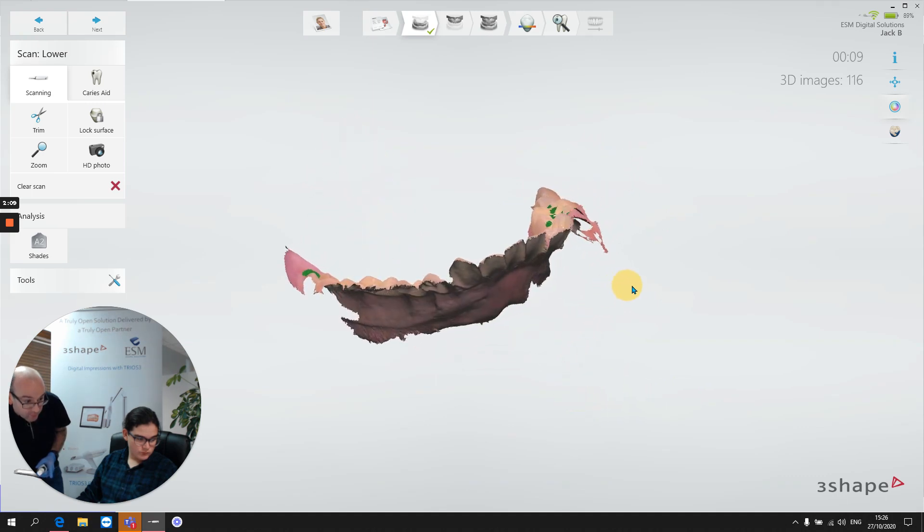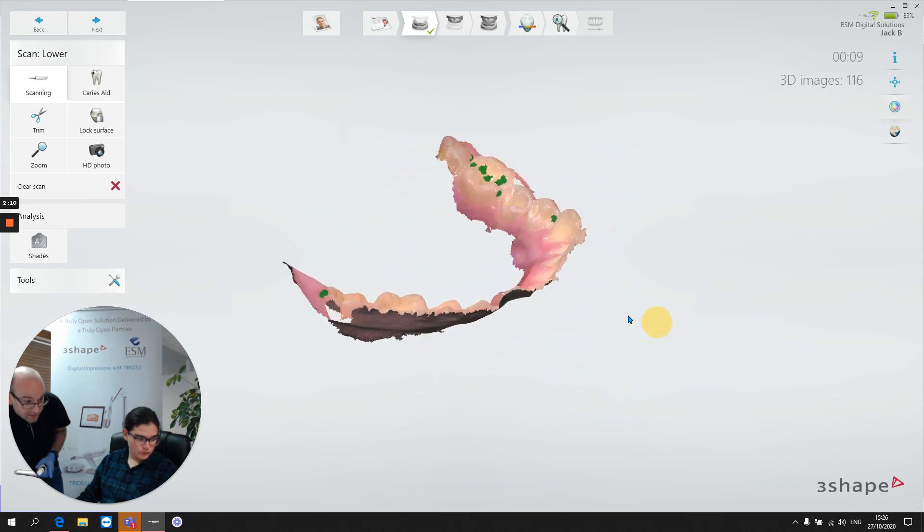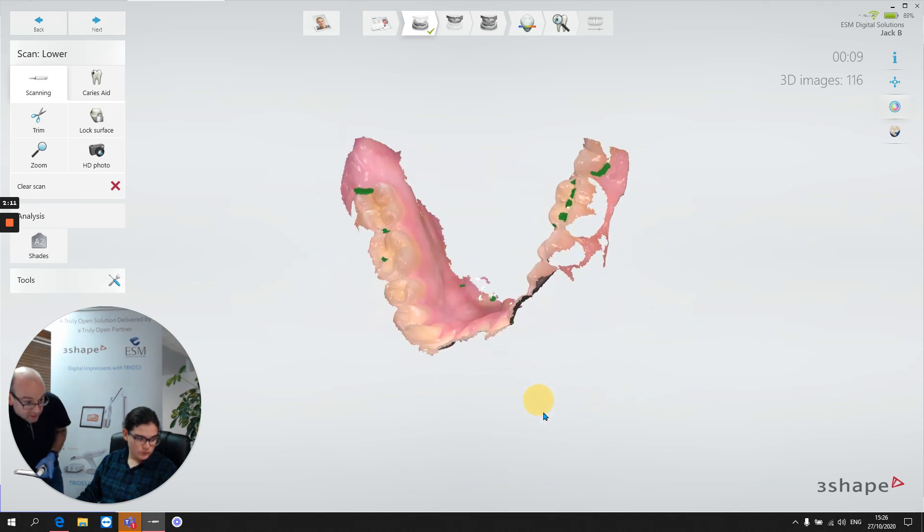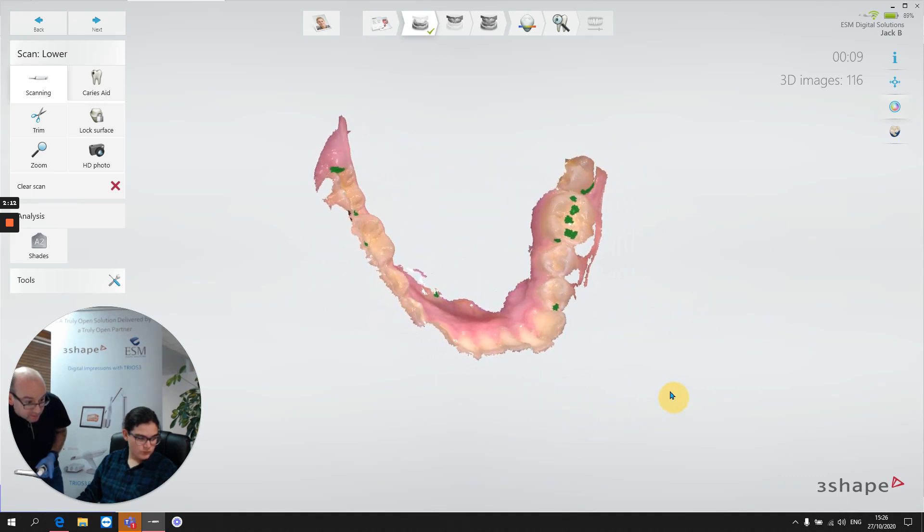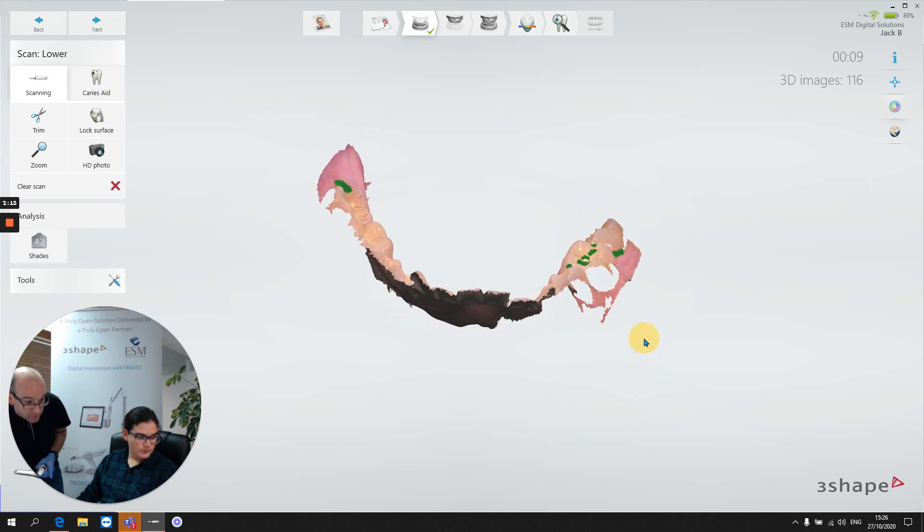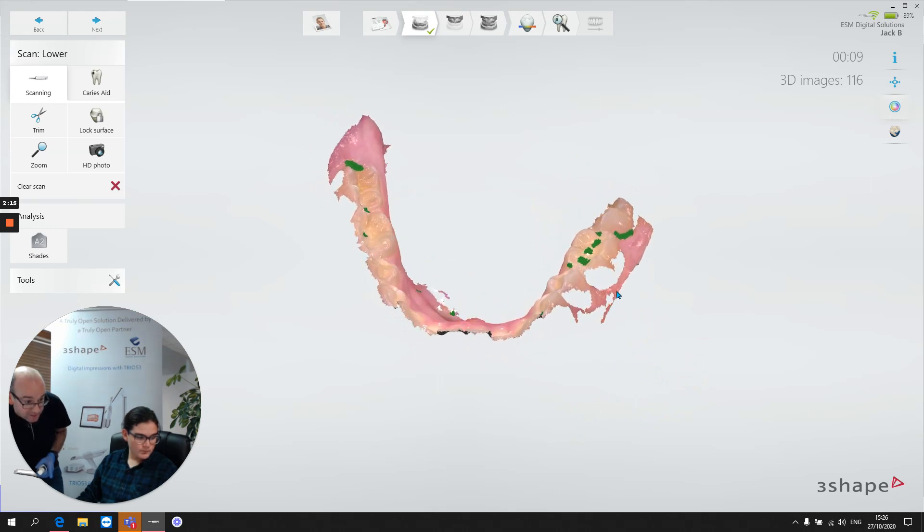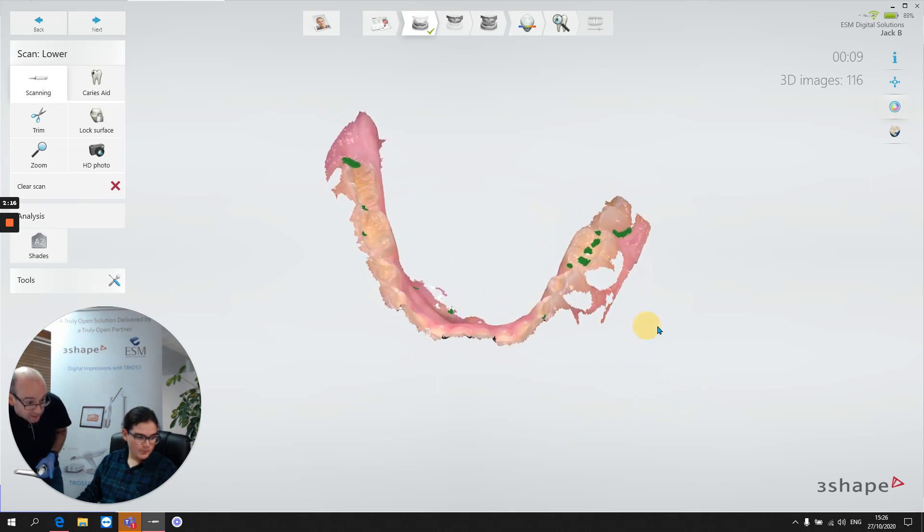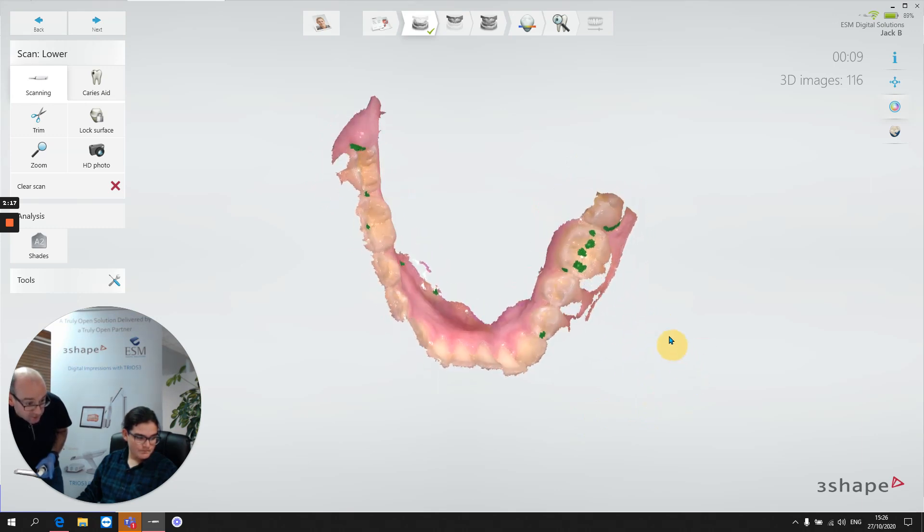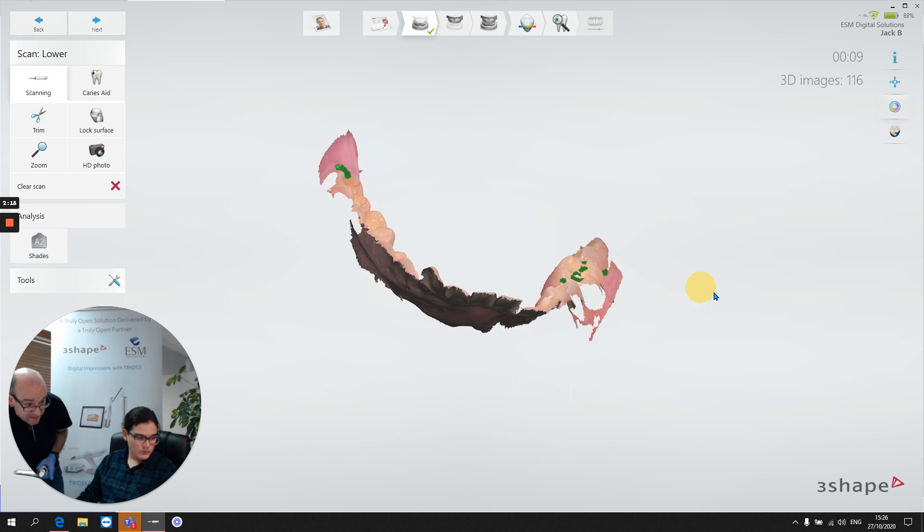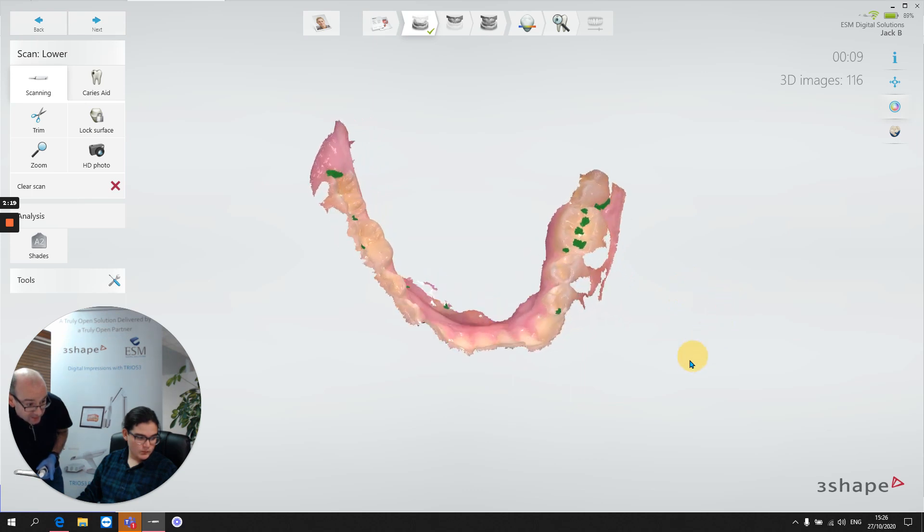But at what cost? And that is the cost is the buccal information. Very, very little buccal information. A little bit there in the left molar, left premolar, and that's it, nothing else.